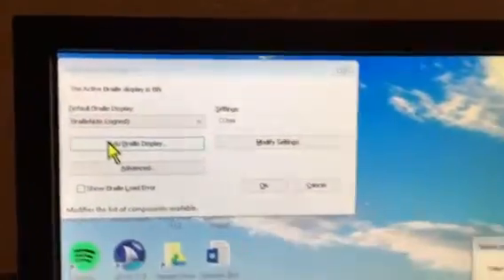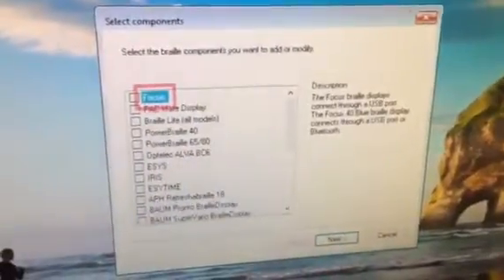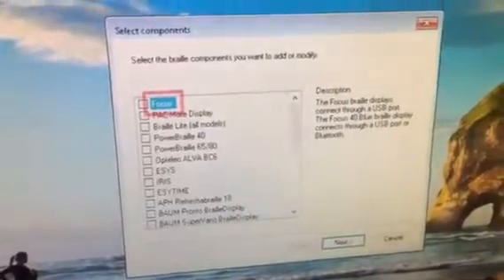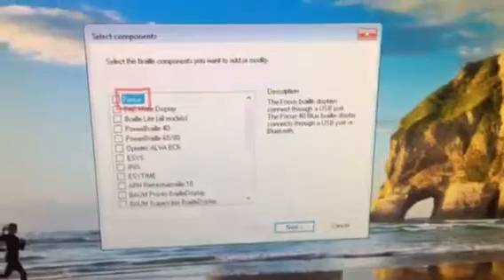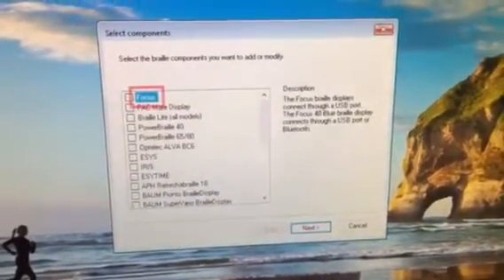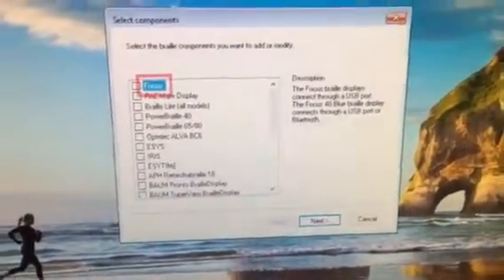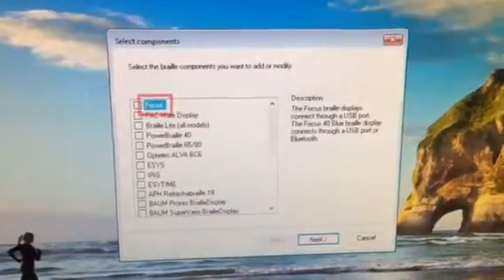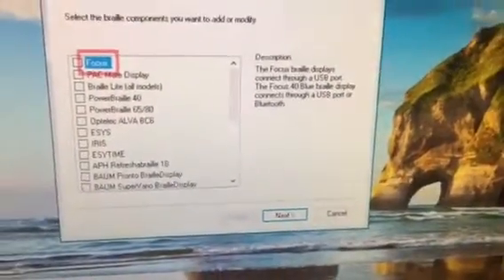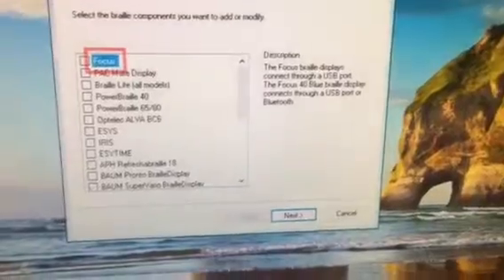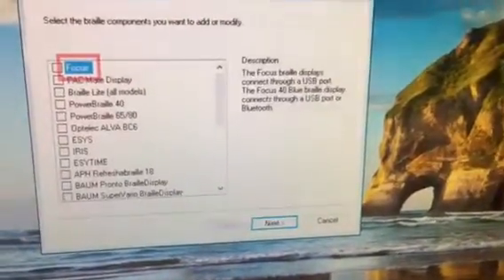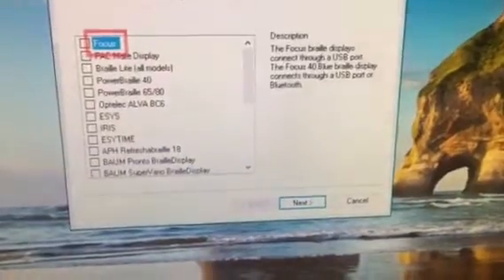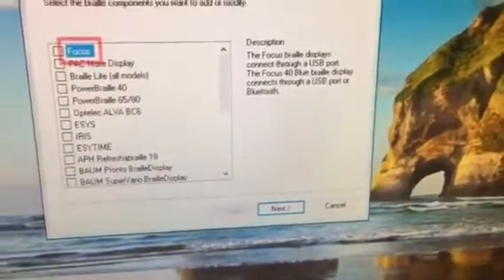Select the Braille components you want to add or modify. Now that you're here, it gives you a list of different Braille components that you can select. We want to select the BrailleNote Apex or anything similar to that.